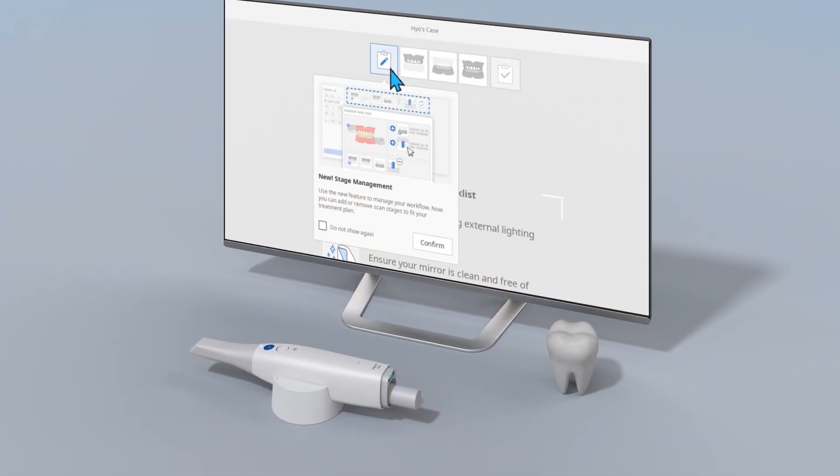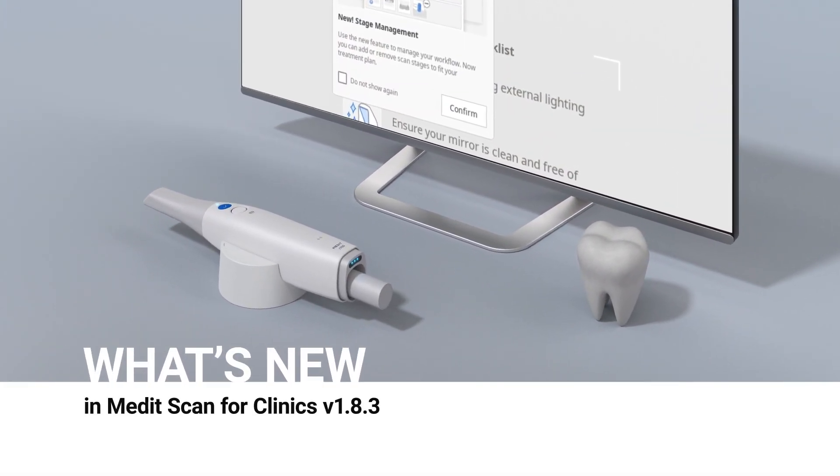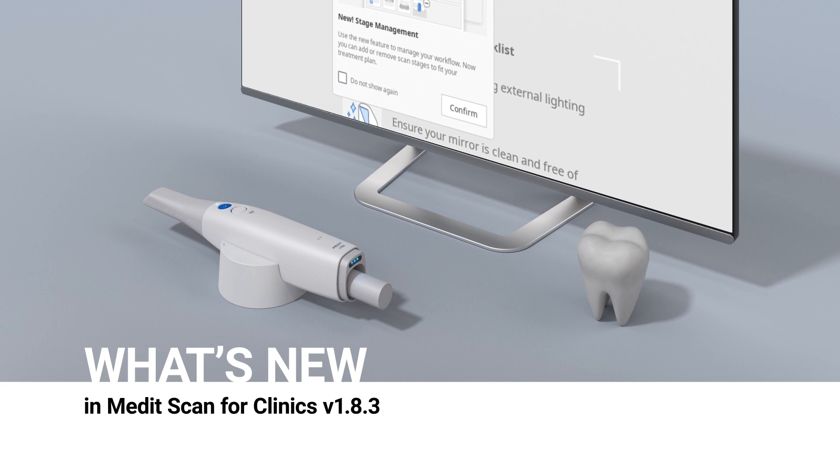This has been a brief overview of the updates in the Medit Scan for Clinics version 1.8.3. Check more on what's new in this version from the release notes in MeditLink.